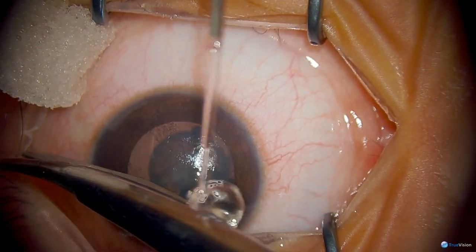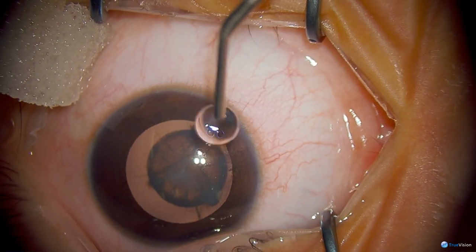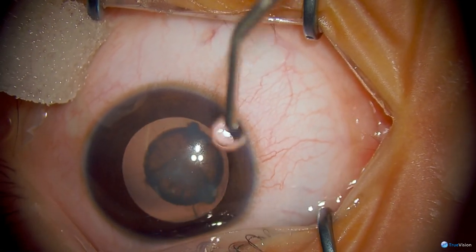This is an interesting case of a nuclear cataract in a 12-year-old girl. She presented with decreased vision and amblyopia in both eyes.